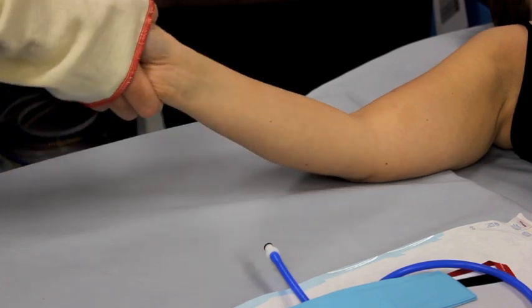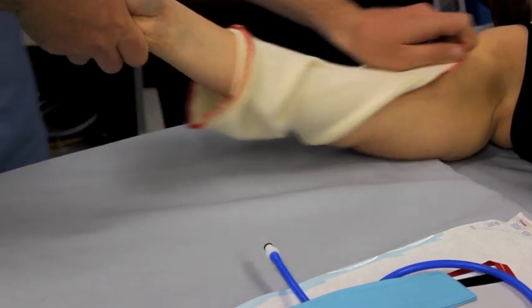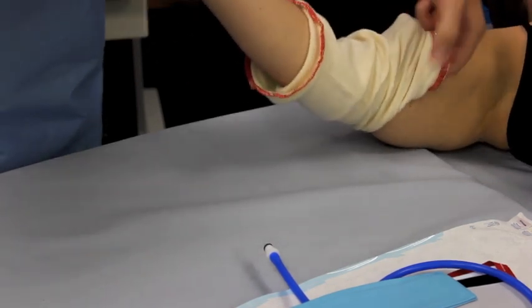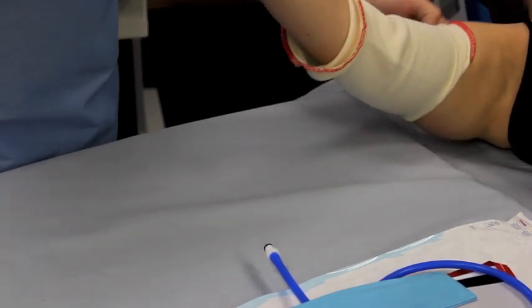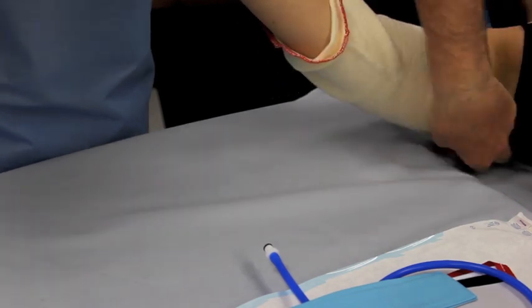It has been suggested in published literature that under padding should be used below the tourniquet cuff. This can help reduce wrinkling, pinching and shearing of the tissues.